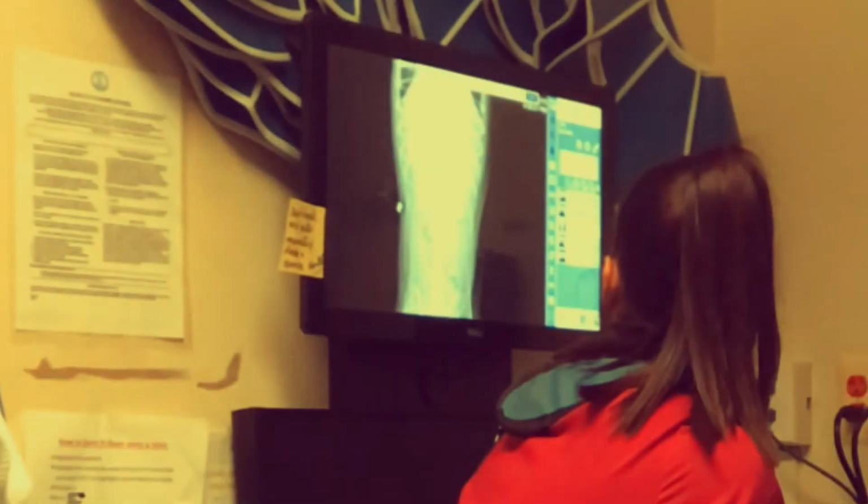Anatomical landmarks to look out for when obtaining a VD abdominal radiograph include the T9 vertebrae, such as the diaphragm, cranially to the greater trochanter, caudally to also show the coxofemoral joints. In canines, the central ray should be ideally centered over the caudal aspect of the 13th rib at L3, around where the umbilicus should be. In felines, the central ray should be centered over 2 to 3 finger breadths caudal to the 13th rib.